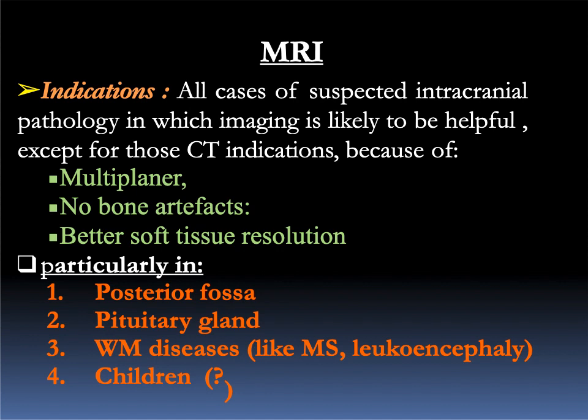For children, actually we have to make a balance. CT is done within seconds, but MRI we have to give sedation and general anesthetic. Most of the time they come for making the patient immobile.